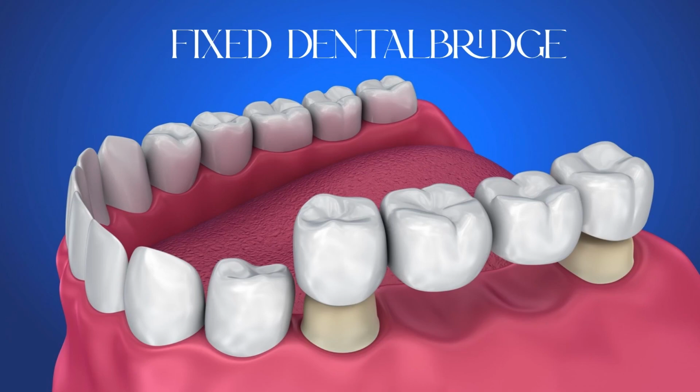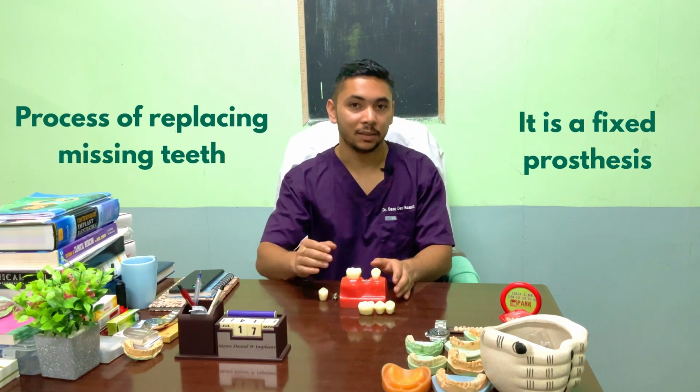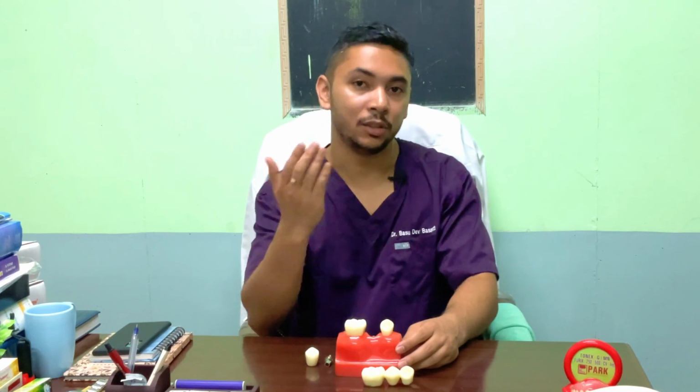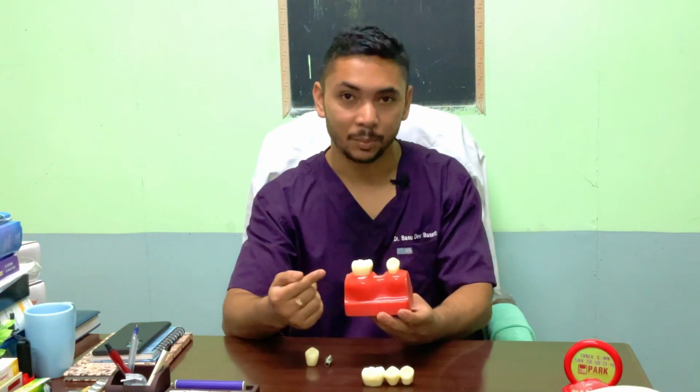Firstly, let's talk about the fixed dental bridge. A fixed dental bridge is a process of replacing missing teeth, and it is a fixed prosthesis. In this technique, if you have a missing tooth, the two adjacent teeth are used to gain support and hence replace your missing tooth. I'm showing you with the help of this model.